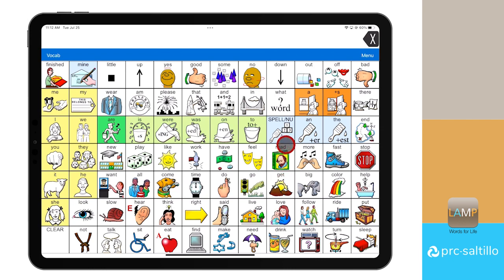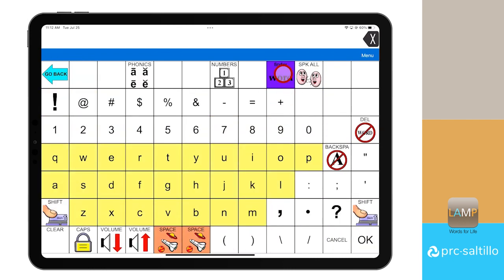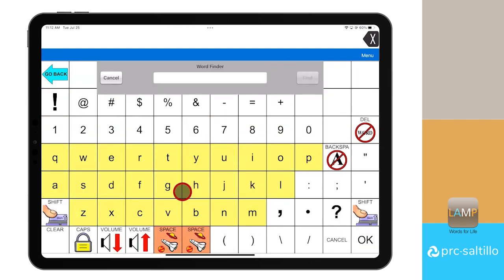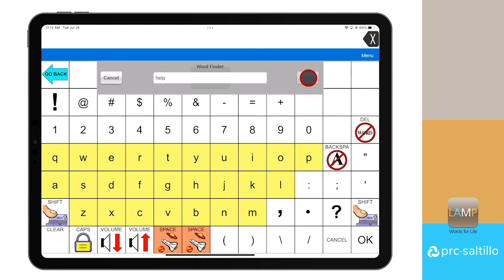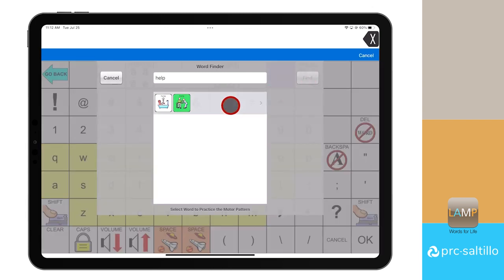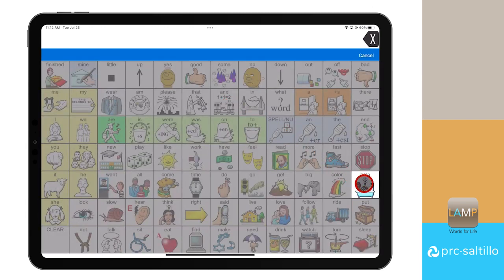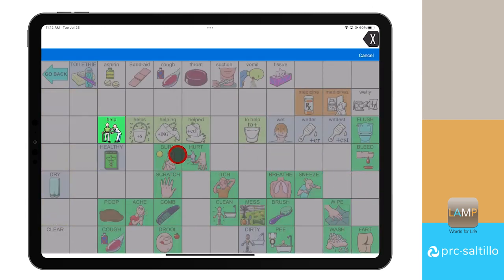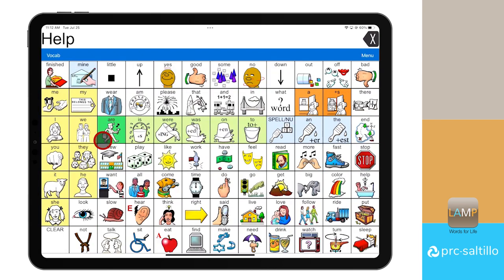You can also use WordFinder as a form of vocabulary builder. Once you find the target word using WordFinder, have the AAC communicator practice the sequence for that word while all other words are hidden. This allows the device user to practice the target word once using the guide me feature.